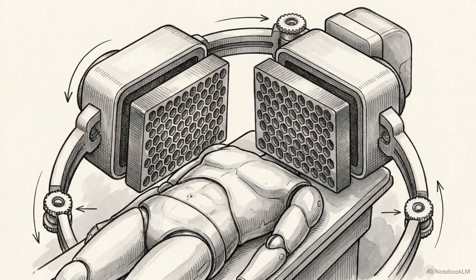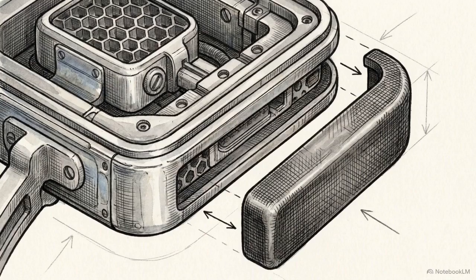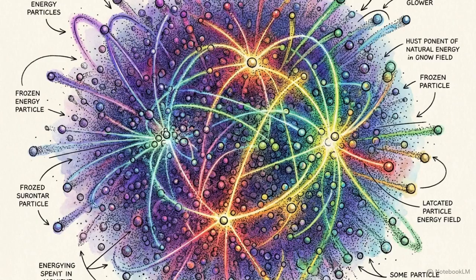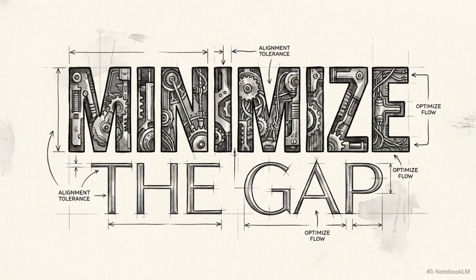This automated body contouring system ensures that the absolute minimum distance between the camera and the patient is maintained throughout the entire 360-degree rotation. To allow for such tight orbits safely, the collimator faces are fitted with pressure-sensitive safety devices that instantly halt movement to prevent any physical contact. In emission physics, proximity is clarity. Every millimeter introduces unrecoverable noise.